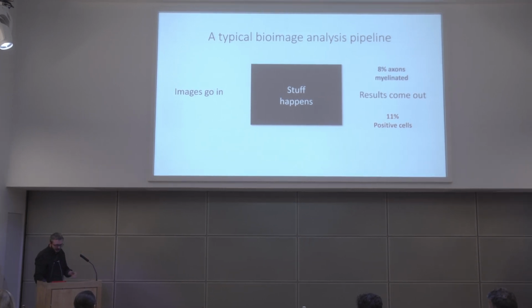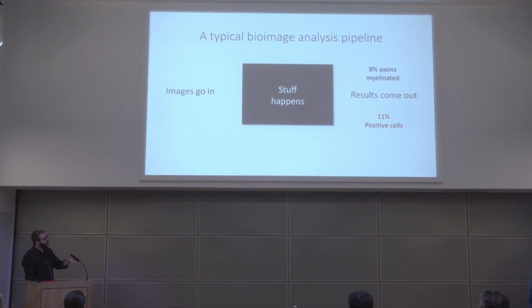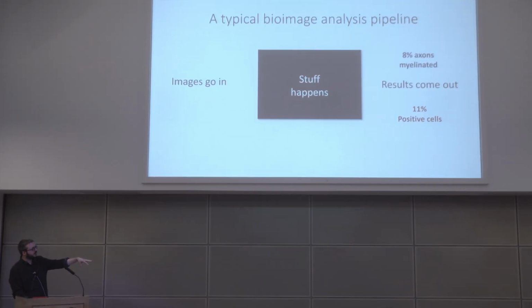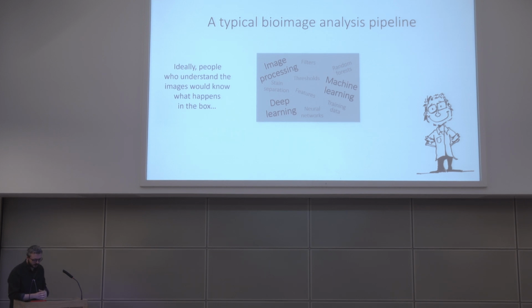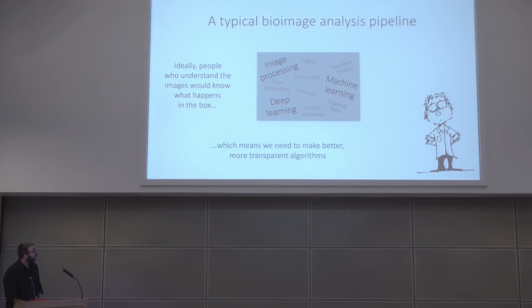And that's something where I don't really want all the responsibility on that, because as the computer scientist, I'm not the one who necessarily is going to really understand how to interpret the results. So what I want to focus on is trying to make the black box as transparent as possible and to actually share what's going on in there and make it accessible to everybody. And so the challenge for me and for people like me is to try and come up with better and more transparent algorithms that make this possible.